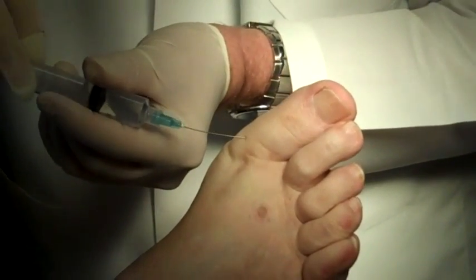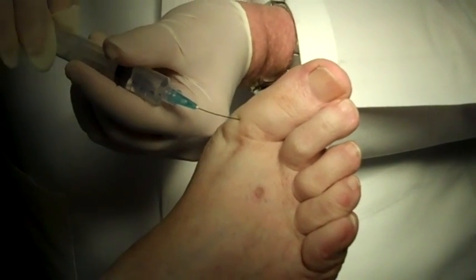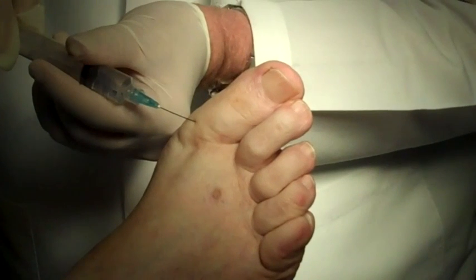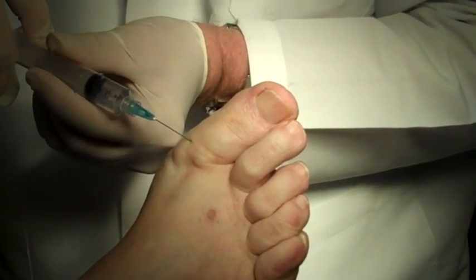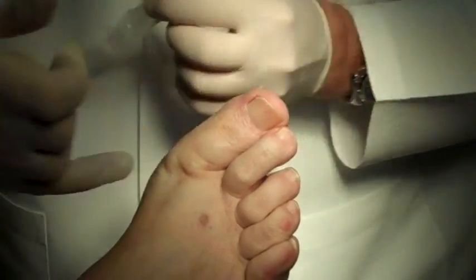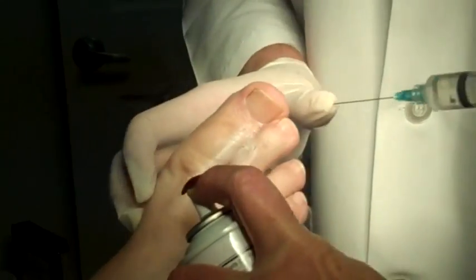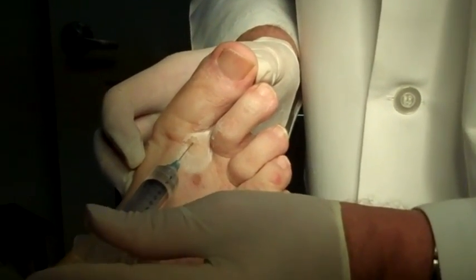We're going to put a little bit on top. And we don't freeze it on this one because we're staying in the same spot that we put the first shot. And we're going to put a little bit on the other side — the side that we're not actually going to work on — just so that when we do it, everything's numb.